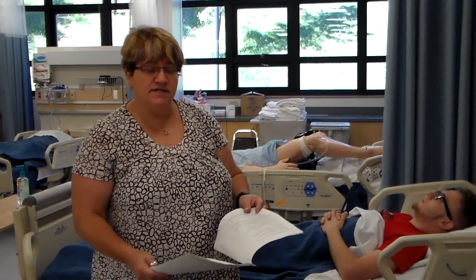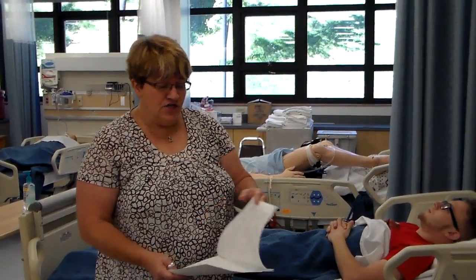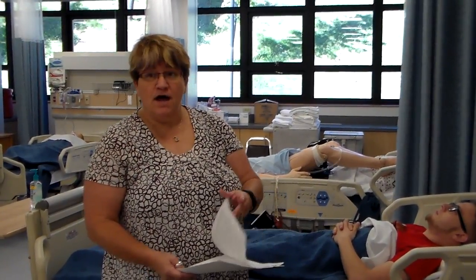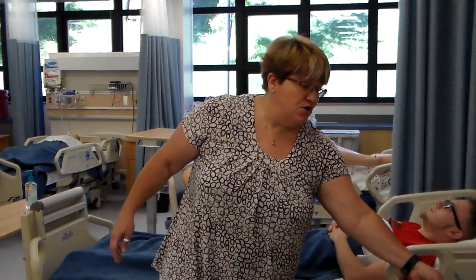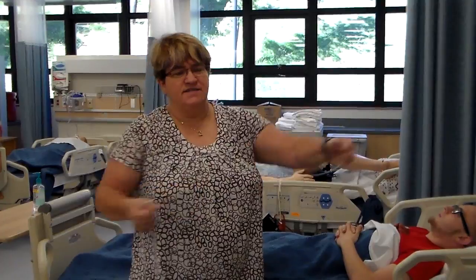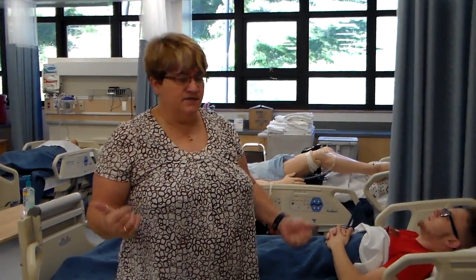Now the last thing you're going to see on your skill checklist is using a transfer board. We do not have one at this facility, but when you go into your clinical settings, you can ask and they'll show you. It's just a stiff board to move a patient. It helps you to move a patient. That's all it is, okay?